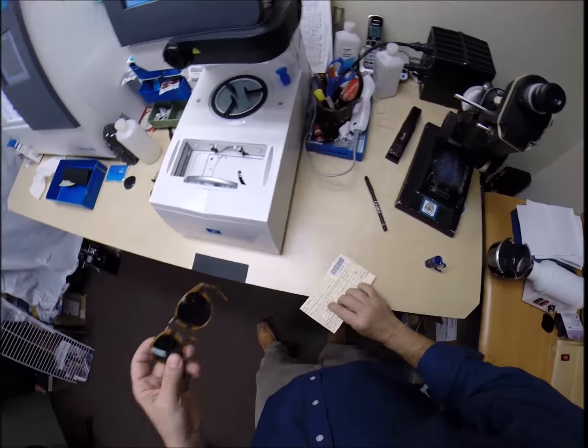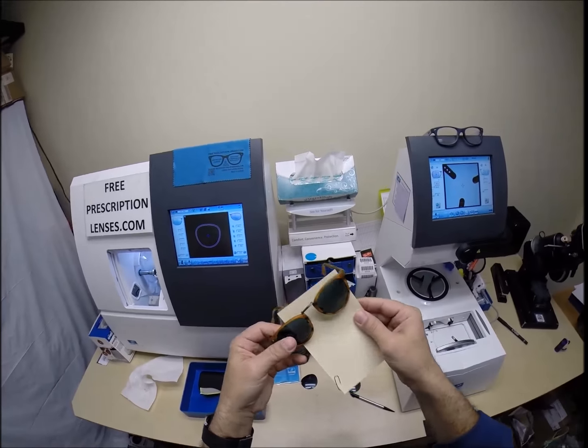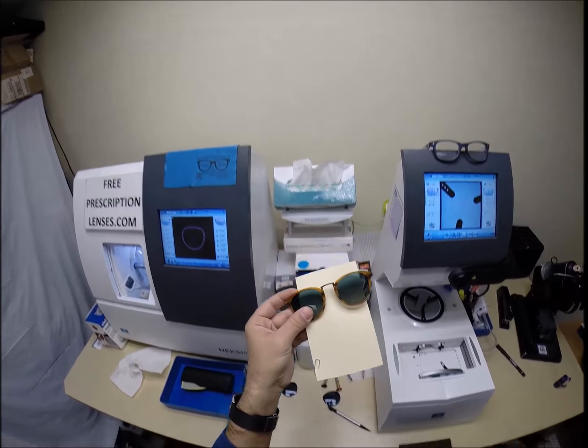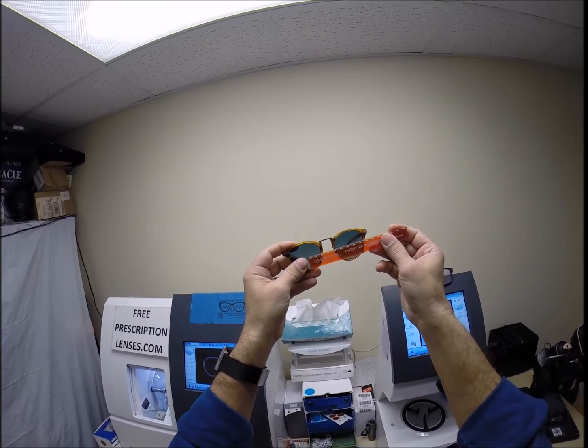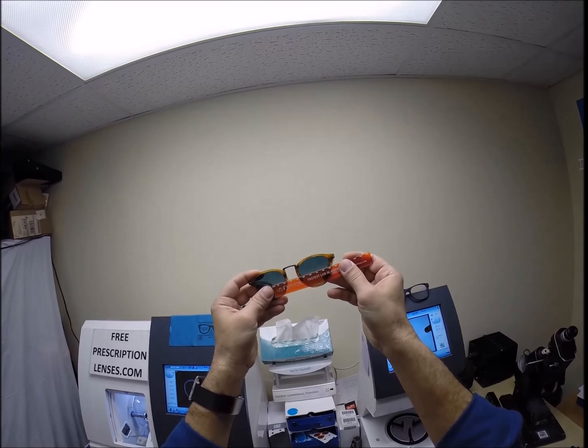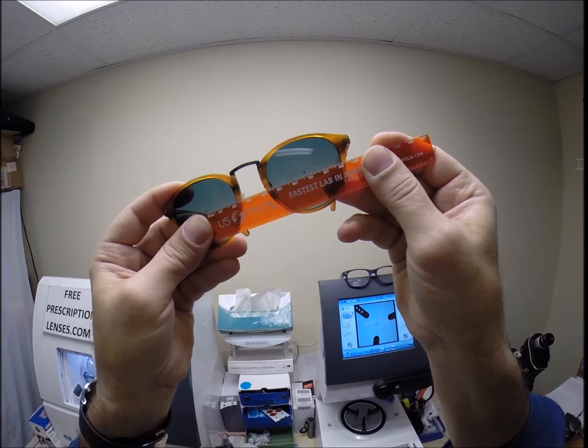So, your pupillary distance. 33 for the right eye. 33.5 for the left. A combined value of 66.5. Actually, I may have to do it without that. Use the wall as the background. Place the PD stick against my thumb on your right lens. And then, when we hold it up to the left lens, we're getting 66.5. So, that is cut perfectly.